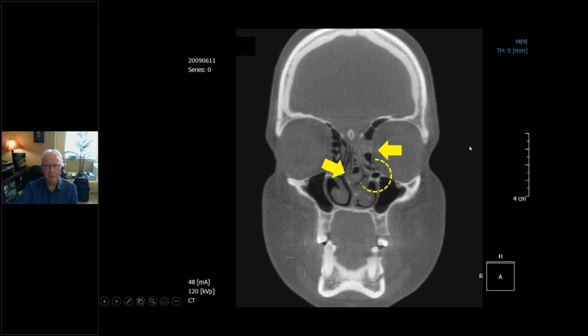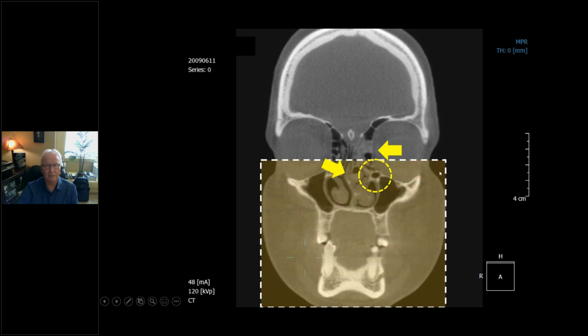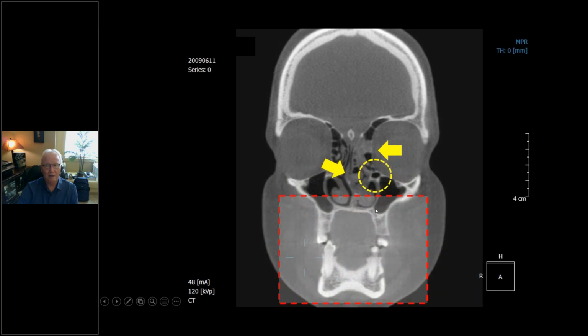And if this inflammatory change affects the osteomeatal complex, the opening from the maxillary sinus into the nasal cavity, you won't see it because your volume captures the dental bases. Some of you have machines that will capture slightly larger than that and get up to the condylar region. Well, if you did that, you would capture some of this material.